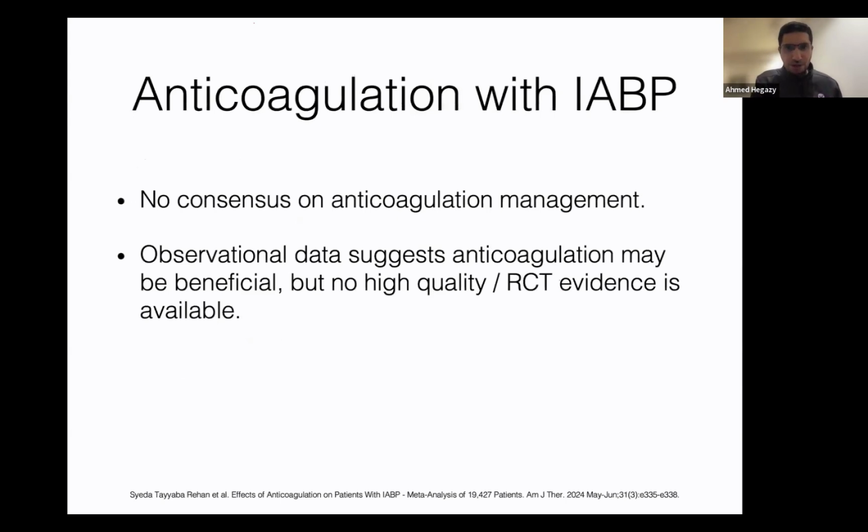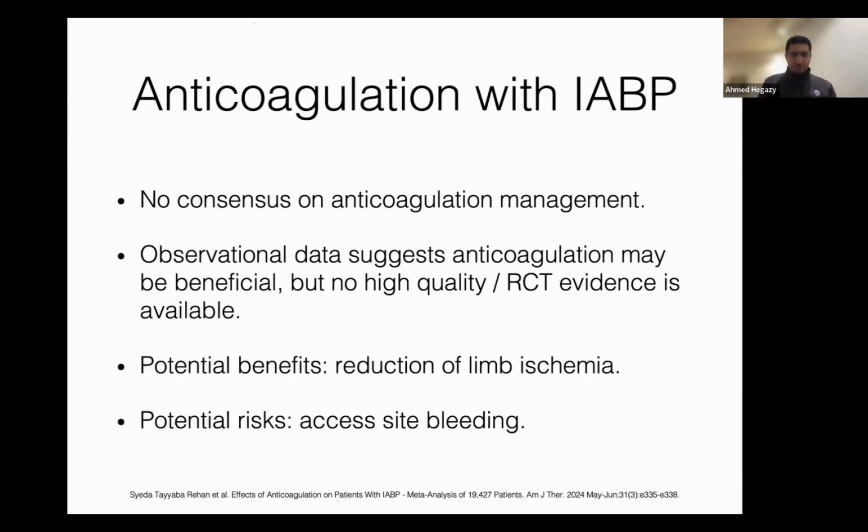So do we anticoagulate patients with a balloon pump? So there's no real consensus on anticoagulation management. Some of the observational data suggests that anticoagulation may be beneficial, but there's no high-quality RCT evidence to guide us with regards to anticoagulation. The potential benefit of anticoagulation is the reduction of limb ischemia and the reduction of thrombosis related to the balloon pump. The potential risks include worsening bleeding from the access site, from the insertion site.